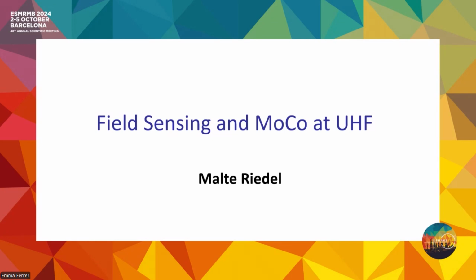So what we see is that we can work, I would say, in a range of 2 millimeters and degrees. Things work fine when you have cooperative volunteers. This method works pretty well, like you have seen. I guess when you come to pediatric applications or something like this, we have to go on solving problems with a method like these unmodeled effects I was talking about. There needs to be progress to make them valuable for these applications as well.